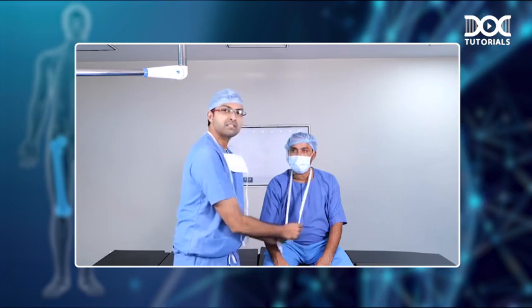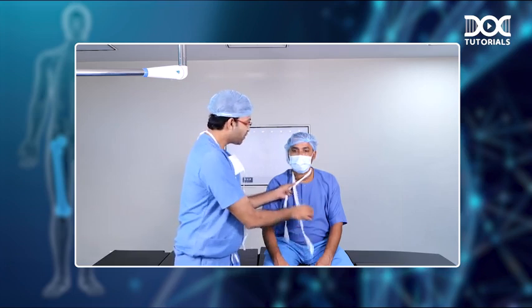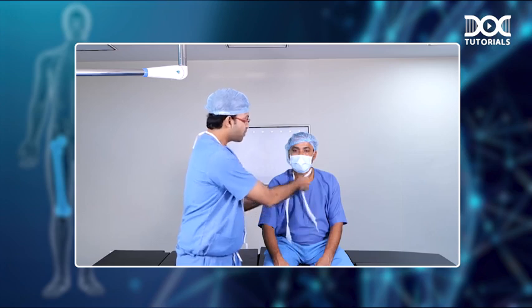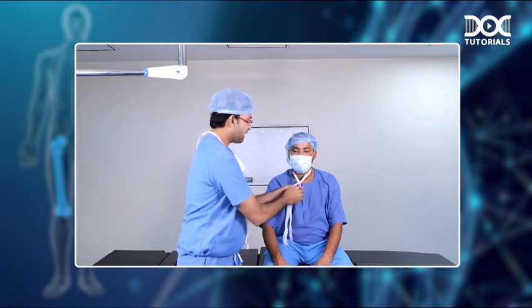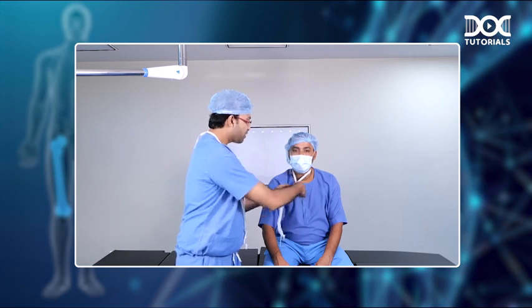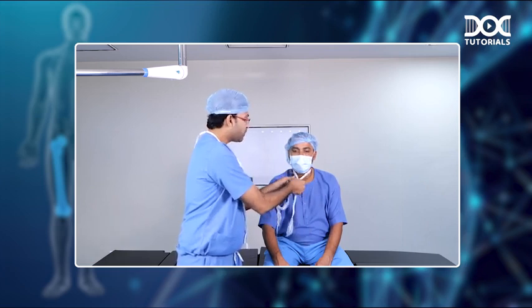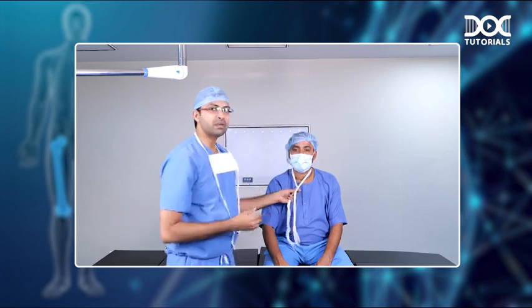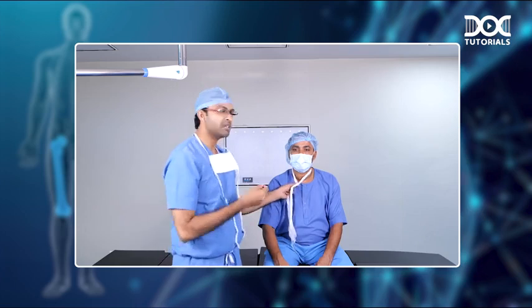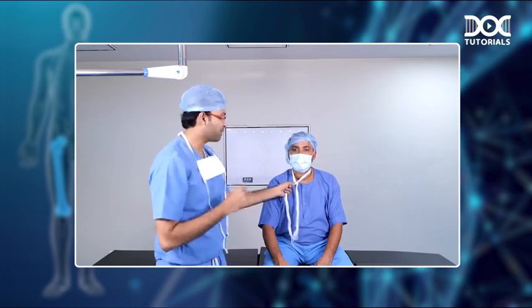Next are the important steps: the way you put knots. There are two knots you have to make. The first knot should be under the neck like this. In this area, it has to be a double knot so that it is secure and does not slip. Whenever you put a knot like this, remember that the chin should be cleared. Why is this important? If the patient wants to take a bath, he can take this out without cutting the C&C sling. That is the point you have to remember.